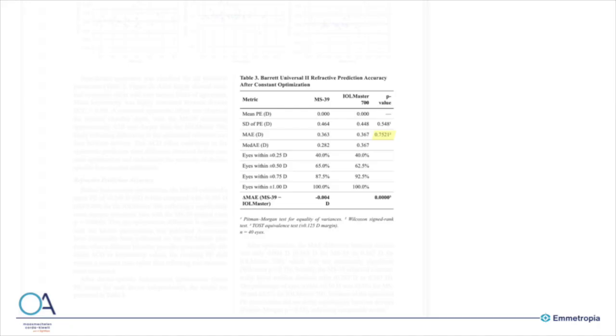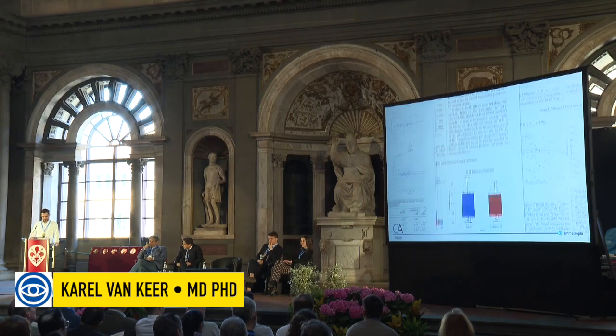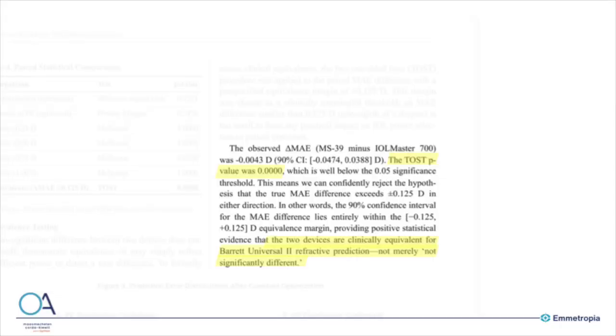But of course, just the lack of a significant difference doesn't imply clinical equivalence. And therefore, we did another test. It's the TOST test, which compares the chance of a difference of 0.125 diopters, which would be the least clinically relevant difference between two devices.